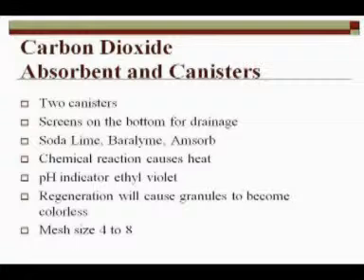Soda lime is granules and 4 to 8 mesh. Mesh size is the number of openings per linear inch in a sieve through which the particles can pass. As particle size decreases, resistance increases. Also, the smaller the granule size, the more surface area is available for absorption.